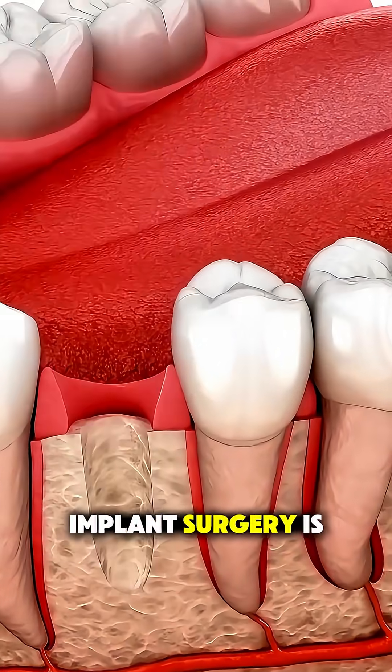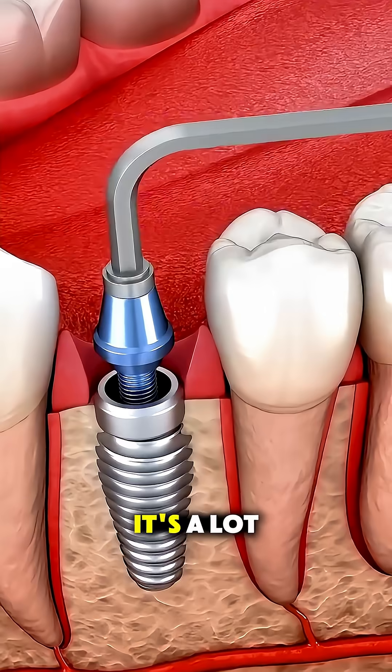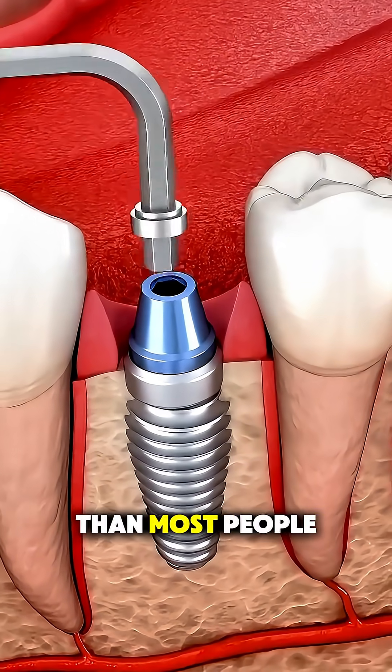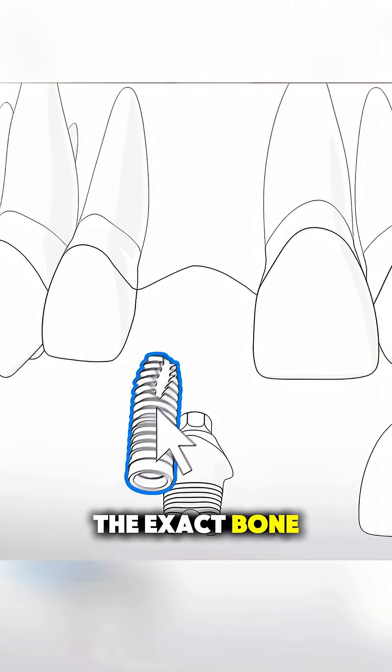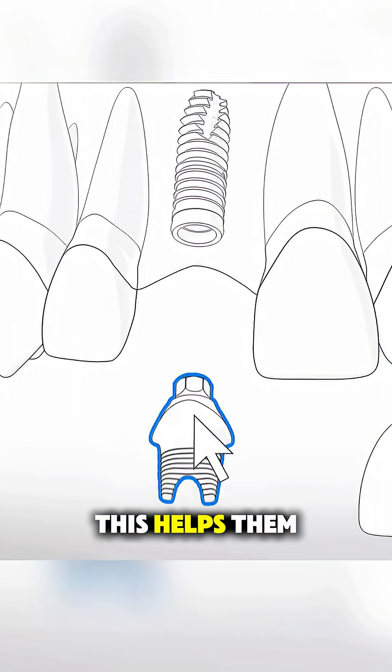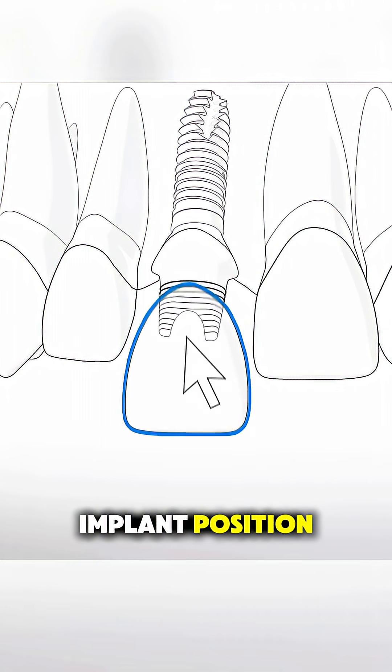Ever wonder how dental implant surgery is actually performed? It's a lot simpler and more precise than most people think. First, your dentist takes detailed 3D scans to map out the exact bone structure of your jaw. This helps them choose the perfect implant position.